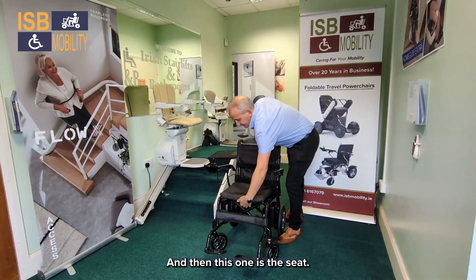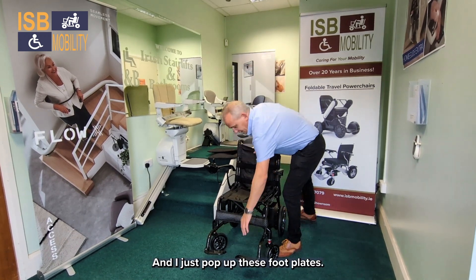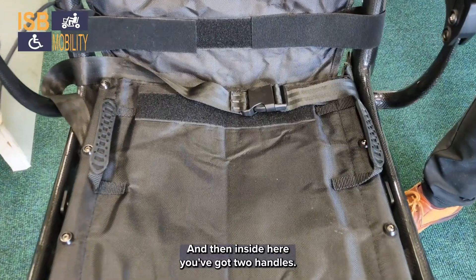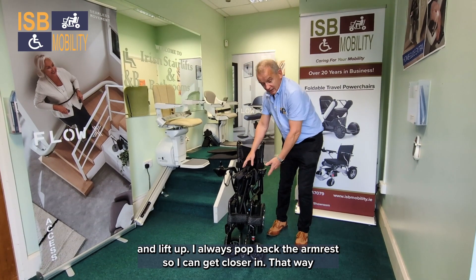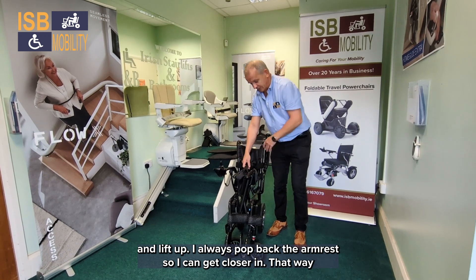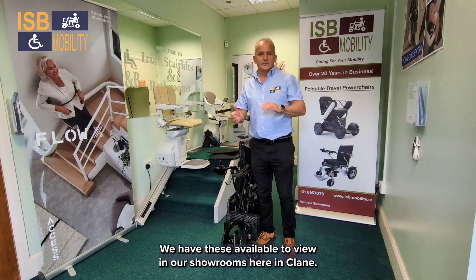So that's the back, and then this one is the seat. Then just pop up these foot plates, and then inside here you've got two handles — you can just pull up and lift up. I always pop back the armrest so we can get closer in; that way you're just lifting the leg.